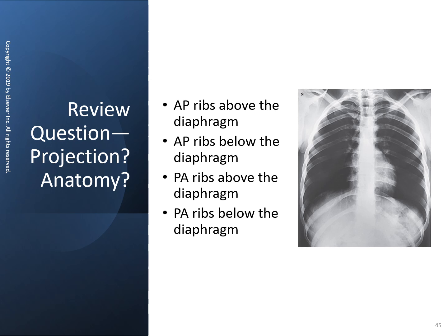All right, last review question, and I think we hit the summary slide and we're done. Wow, I went through this fairly quick for me. All right, so what projection is this now? Okay. Now it looks to me like the anterior ribs are sharp. Okay, you can see them rolling around the corner. They're the ones that slant. They're slanting in from the axillary regions.